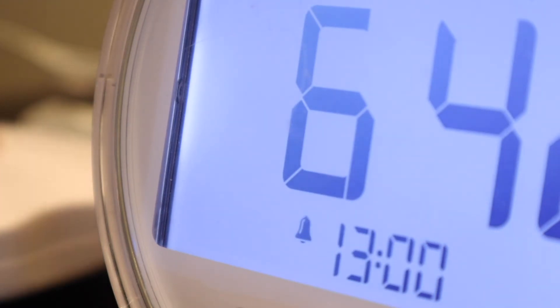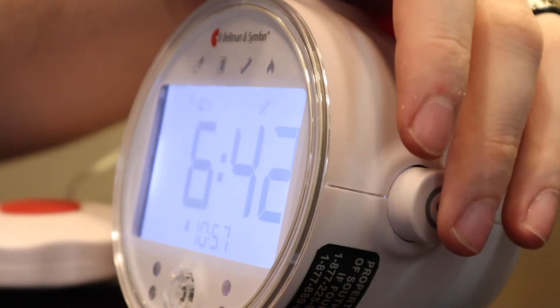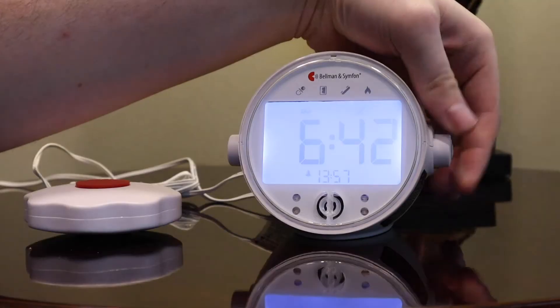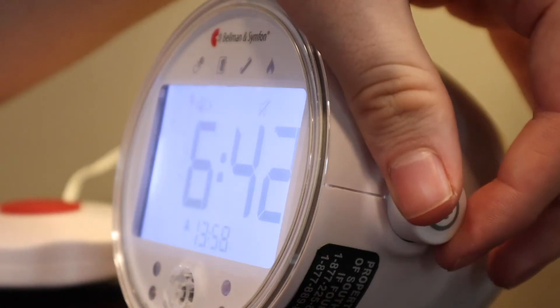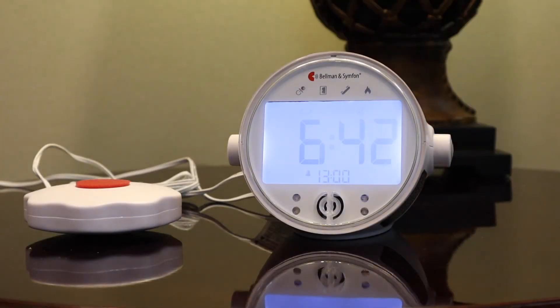Next, let's set the alarm. To set the alarm, press in the right dial and turn it to set the hour. To set the minute, press the dial again and then turn it to see the minutes start to change. Pressing the button again will save the time.